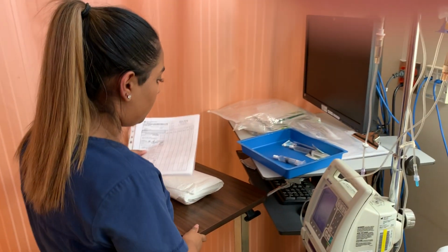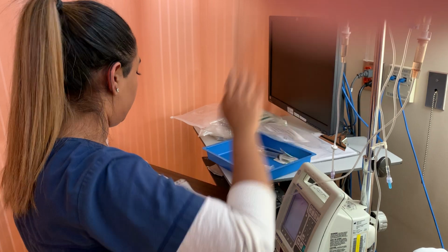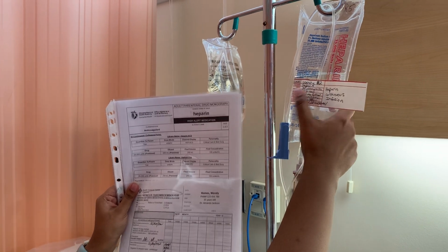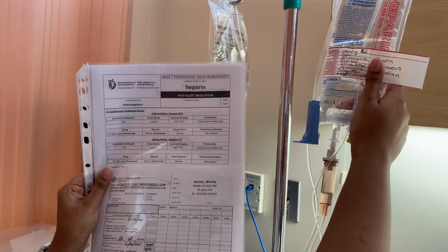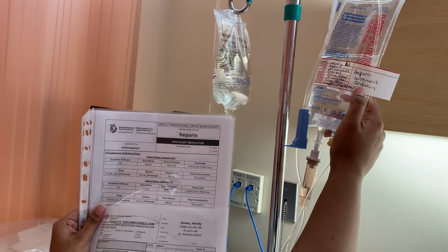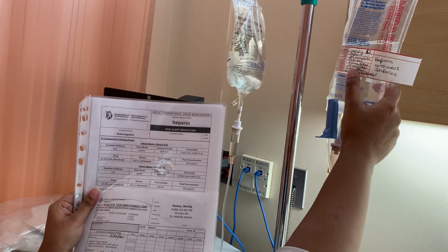So what I'm going to do is come to the bag that's already down here. I'm going to make sure we confirm my patient. We have heparin. We have the 25,000 units, which is correct. It's a 250 ml bag. We have the final concentration of 100 units per ml. We're going to be giving it via IV continuous. And the correct time is now. We have 2 nurses' signatures here.